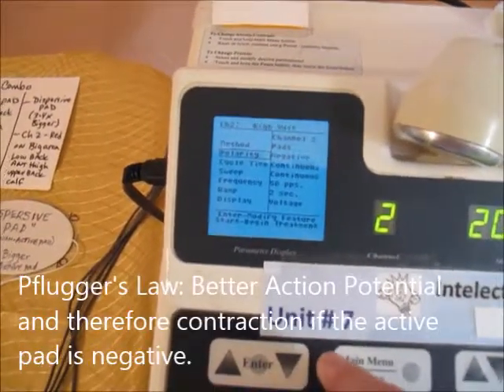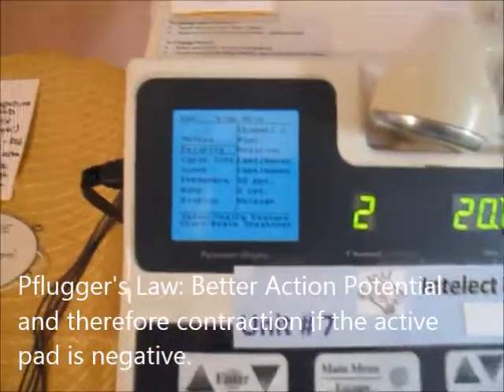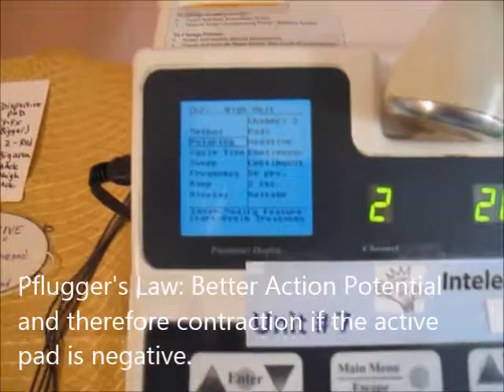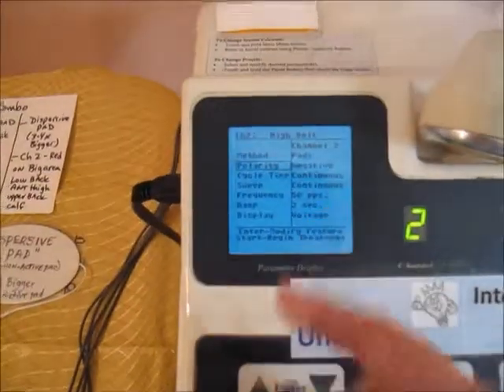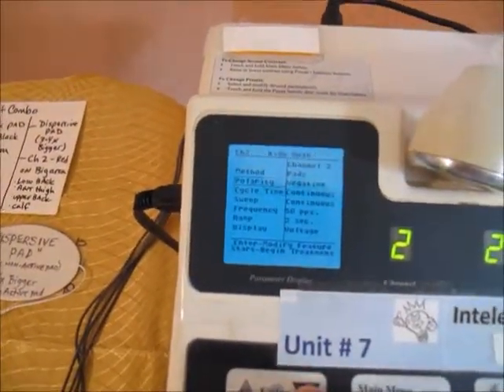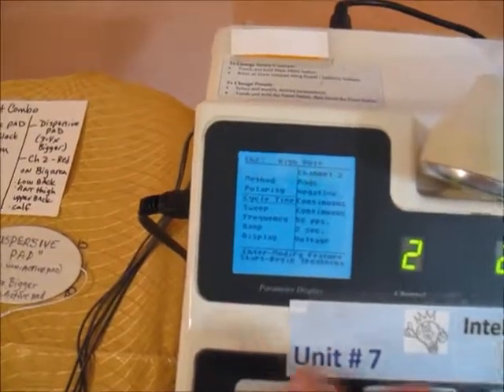This has to do with the thing called Pfluger's law, which states that you get a better action potential under the negative pad. So we always set our active pad, which is the small pad that we used over here, to the negative. After you do that, we're going to look at cycle time here.